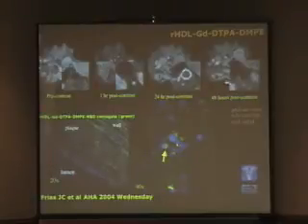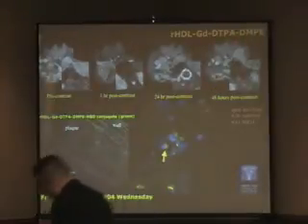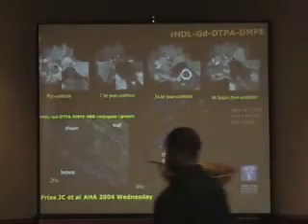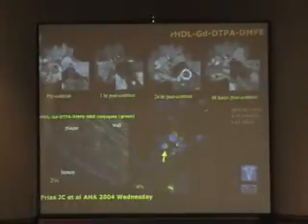What's also interesting is that the particle by itself, which does not have any target right now, naturally goes in and enhances the vessel wall at 24 hours, and after 48 hours it gets out. So it's really going in and going out, and we have ways, and you can imagine ways, we can potentially make this stick into the vessel wall and target certain epitopes. So we will be following up. J.C. Frias will be presenting this when everybody left already on Wednesday. But for the people who are here, we'll see this.